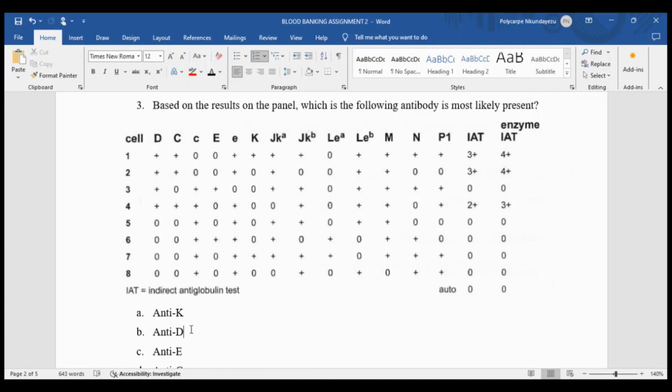This is quite small, and someone is going to take us through. Yes, please. Who is going to take us through this panel? Yes, Caroline. You're going to take us through it quickly. Okay, so now which cells are going? So this is how you start. You have to start with the cell. Which cells will be used for exclusions?